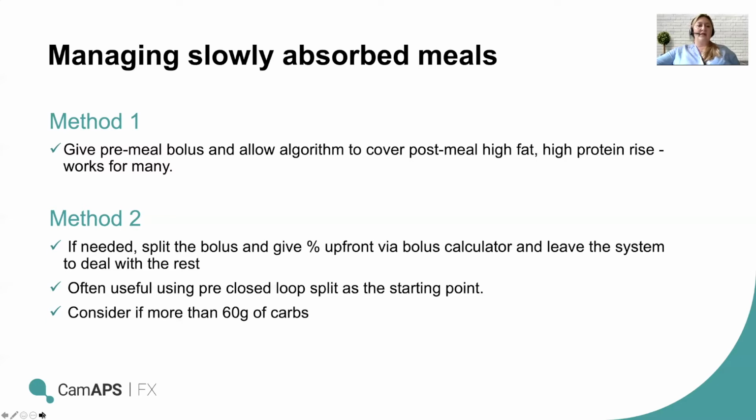And again, for many people, that will be enough. The system will just deal with the additional carbohydrate as it comes through later on, and it's definitely worth considering splitting the bolus if your carbs are more than about 60 grams.